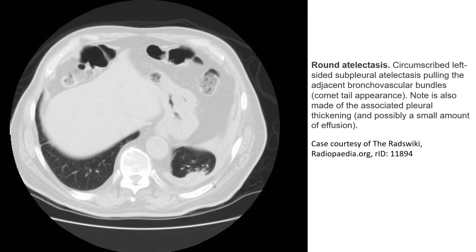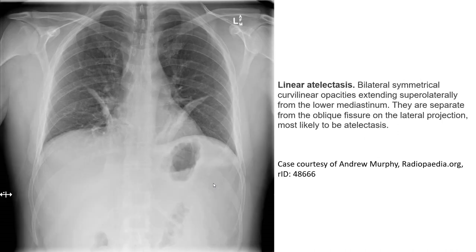On CT, circumscribed left-sided subpleural atelectasis following the bronchovascular bundle was seen. CT also showed bilateral symmetrical curving linear opacities extending superolaterally from the lower mediastinum, separate from the oblique fissures on lateral projection, most likely to be atelectasis.